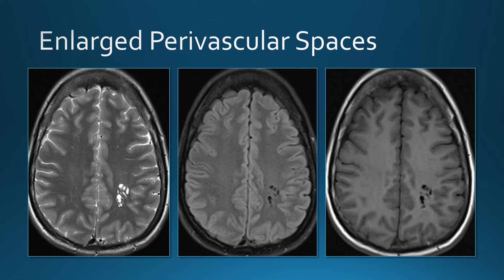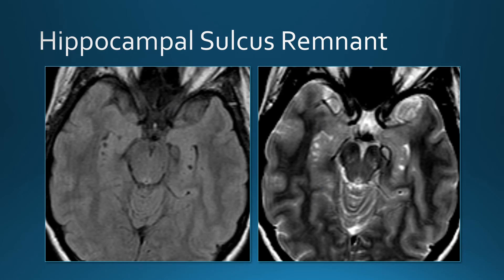Another patient with enlarged perivascular spaces in the subcortical regions. This patient has CSF-intensity areas within the hippocampi — these are remnants of the hippocampal sulcus, formed during the infolding of the hippocampi and considered a normal variant.